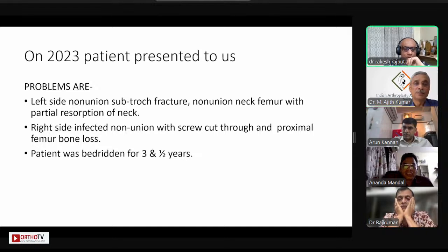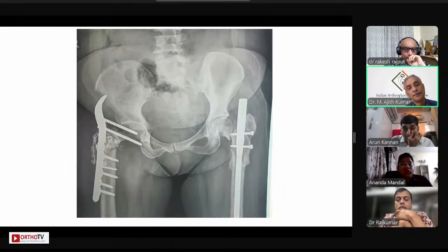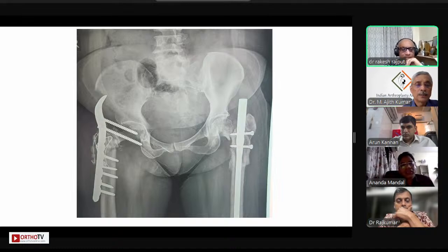And keep in the X-rays. In the interim, I think I would put a cement spacer, vancomycin loaded or whatever loaded, cement spacer. Investigations? I mean, yeah. So Anand, on the right side, I think the decision is much easier. You need to take out all this metalwork and beads and then put a cement spacer, because that femoral head and subtrochanteric area is gone.